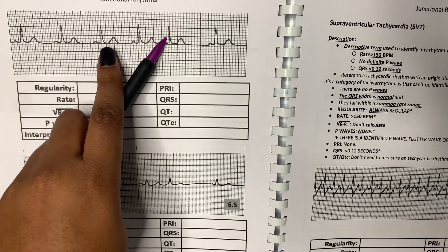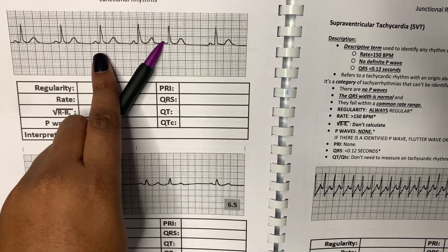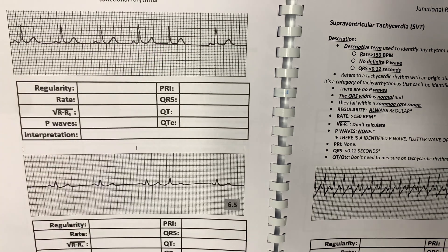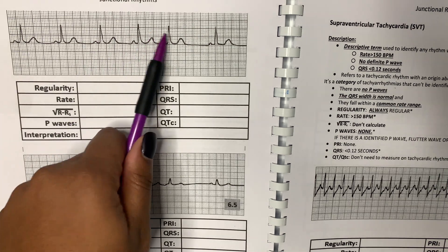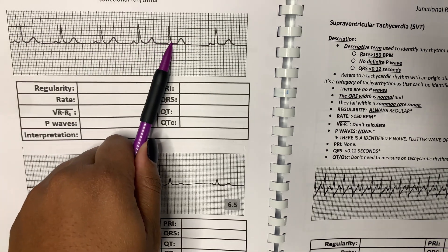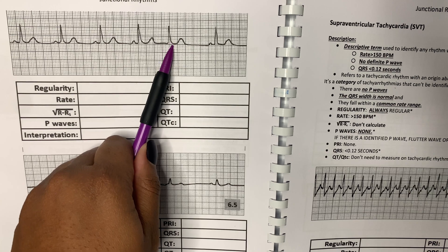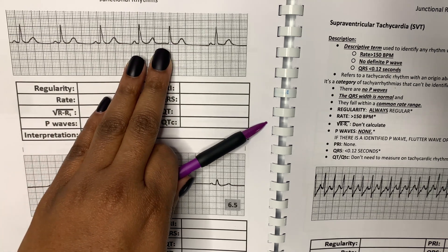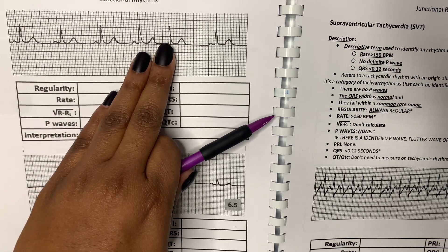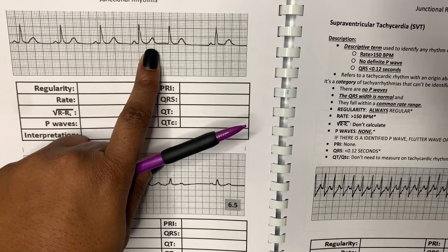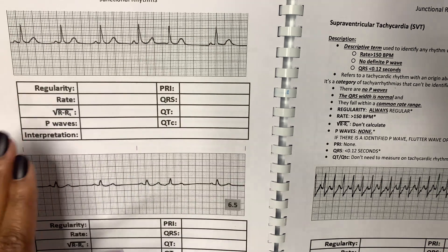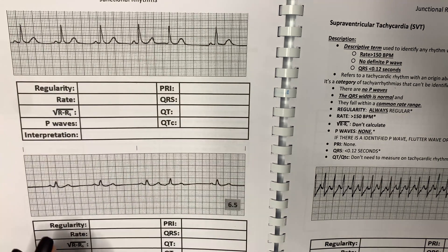If you look here, you can't really see the P wave — it's basically non-existent, but it's probably hiding within the QRS. But regardless, if you can't identify the P wave or if it's inverted upside down, then that's a PJC.